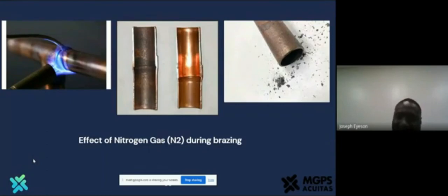So the idea is to eradicate all carbon deposit in the pipe. Nitrogen should be obtainable in your local area. Try to find out where you can get nitrogen for this work, or find the best way of purging it out. But it's mainly oxygen, and then air, medical air. Other gases, it is not strictly required.